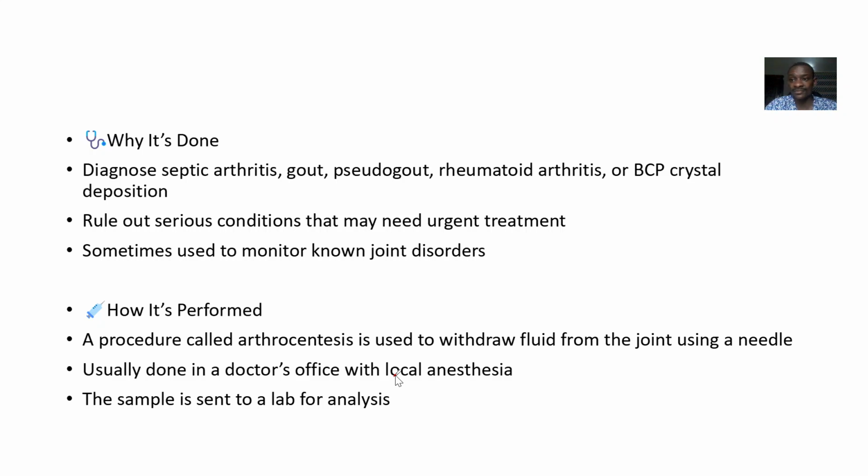So why is it done? You can use synovial fluid to diagnose a lot of knee joint issues like septic arthritis, gout, pseudogout, rheumatoid arthritis. Okay, so you can also use it to rule out serious conditions that may need urgent treatment. Sometimes it's used to monitor known joint disorders.